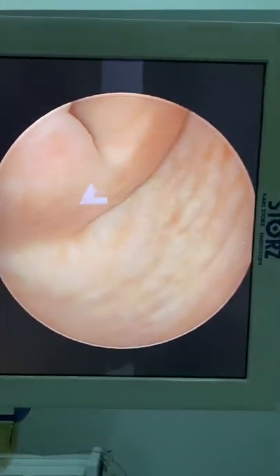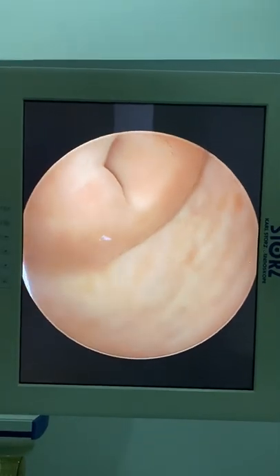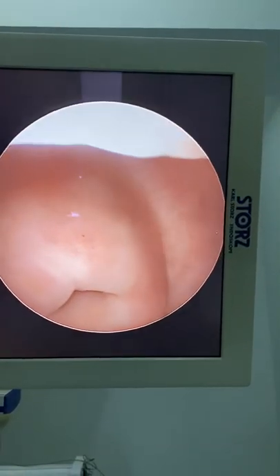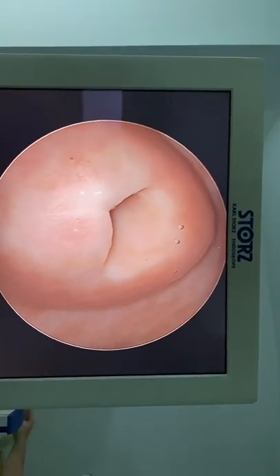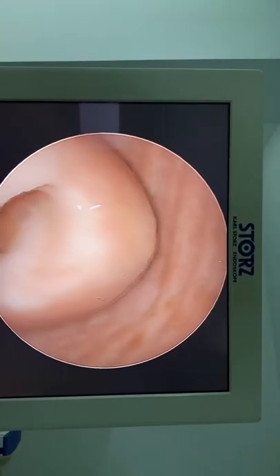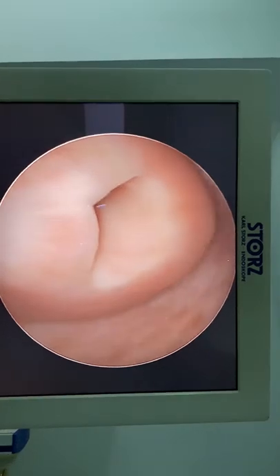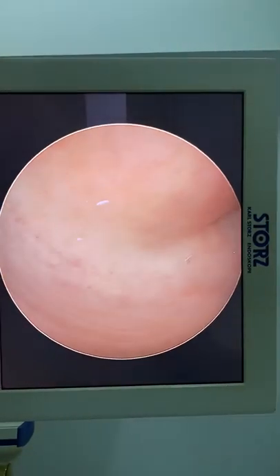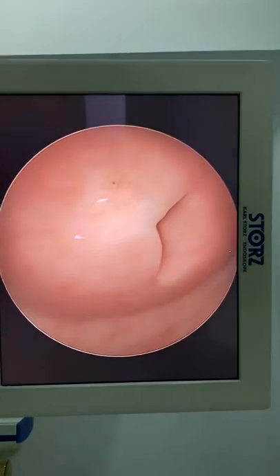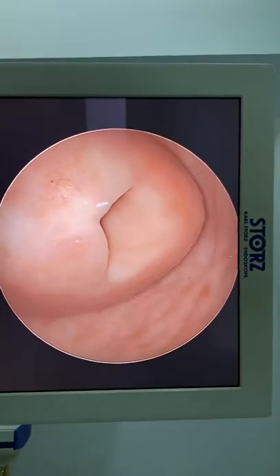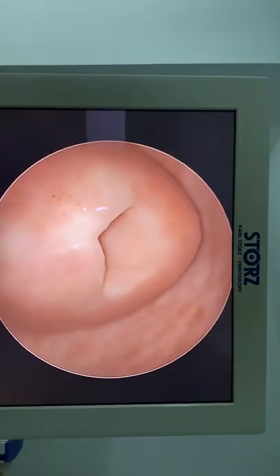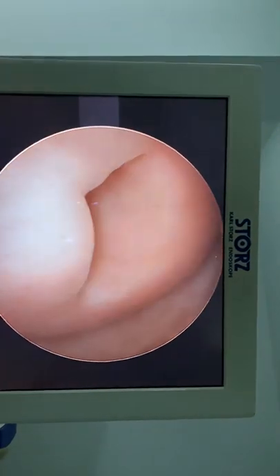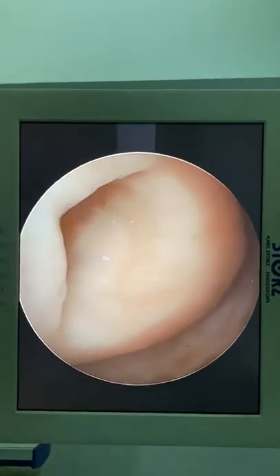This is the vaginoscopy. She has a very short vagina; the cervix is looking upwards — almost as if worshipping the sky. So from that direction, can you guess: is the uterus anteverted or retroverted? Apparently slightly retroverted, but we don't know because inside the pelvis there will be a lot of it.